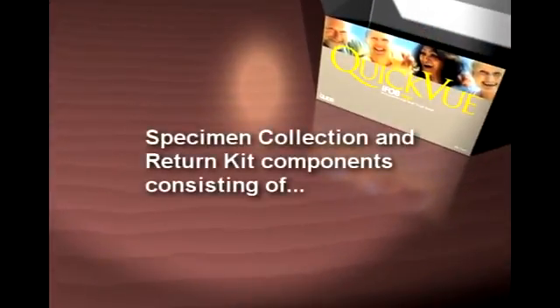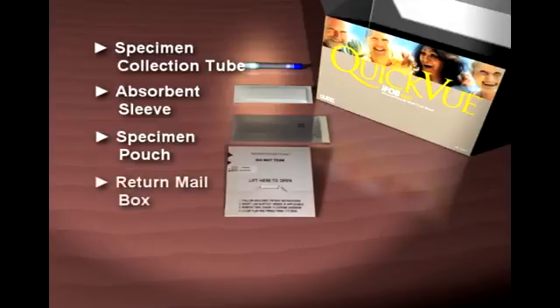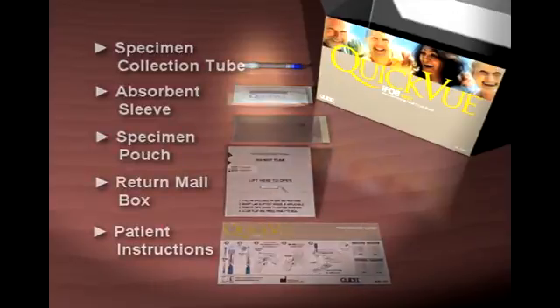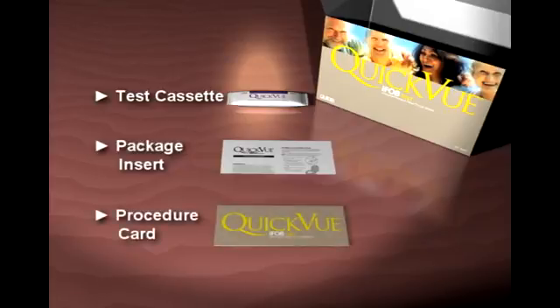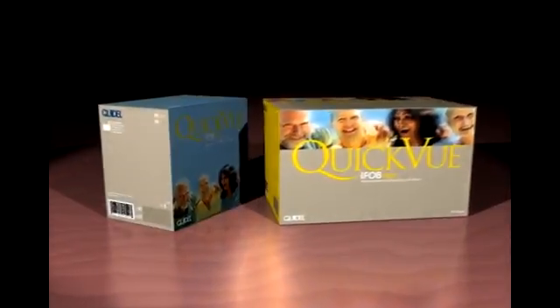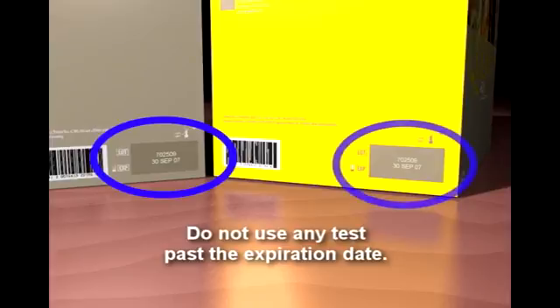Specimen collection and return kit components consisting of specimen collection tube with patient identification label, absorbent sleeve, specimen pouch, return mailbox, patient instructions. The test cassette sealed in a foil pouch, package insert, procedure card. Check the expiration date on each individual package before using. Do not use any test past the expiration date.